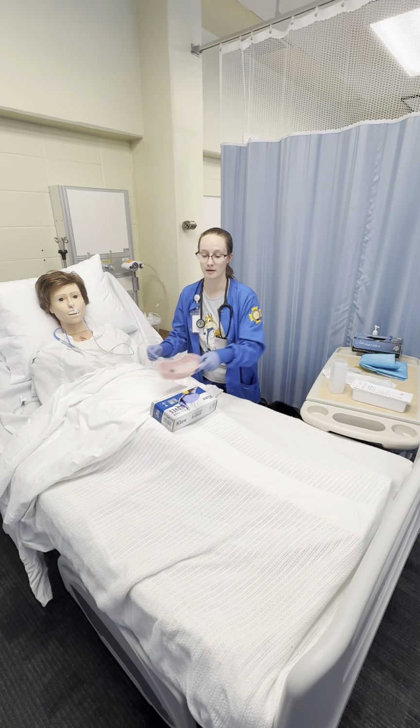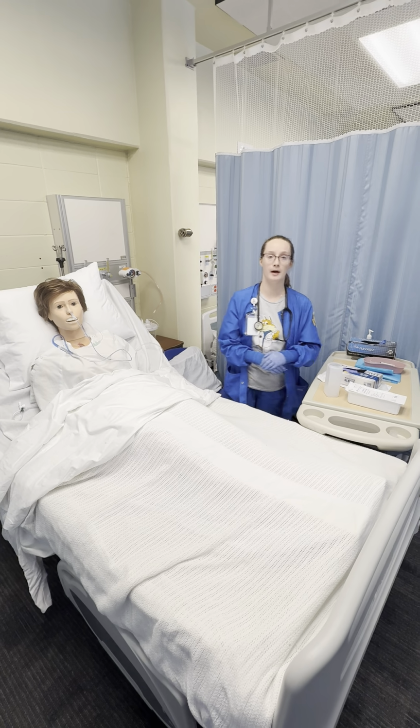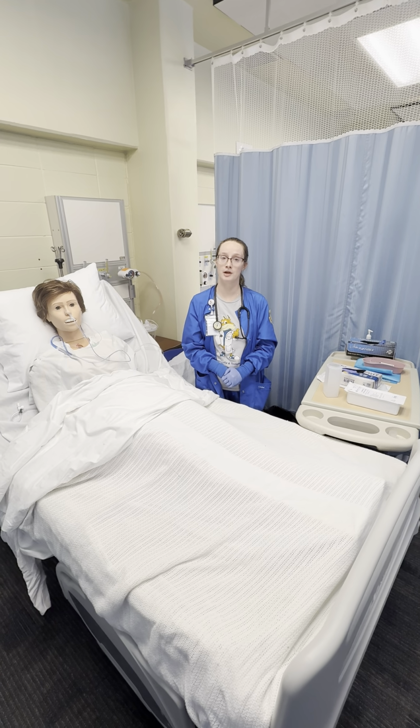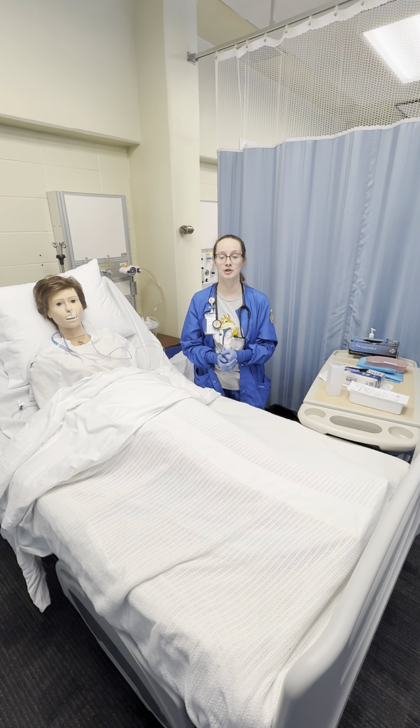And I'm going to clean up my area, provide the patient some privacy, and I'm going to report and record the procedure that was done, document the measurements that I've gotten, and hand the patient the call light and exit the room.